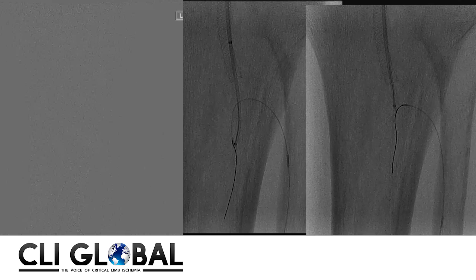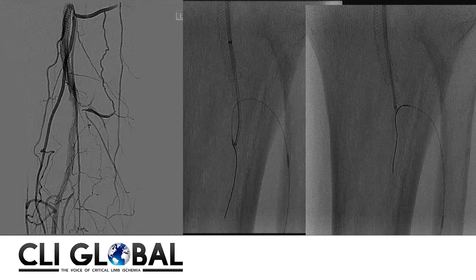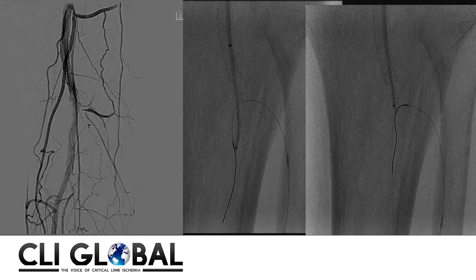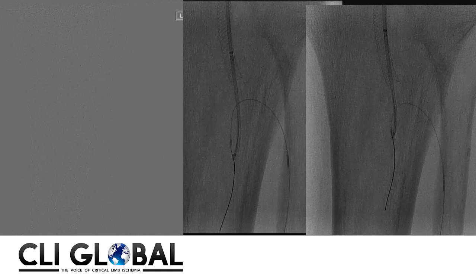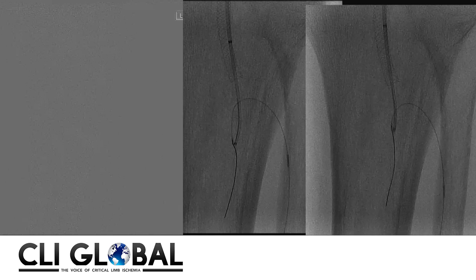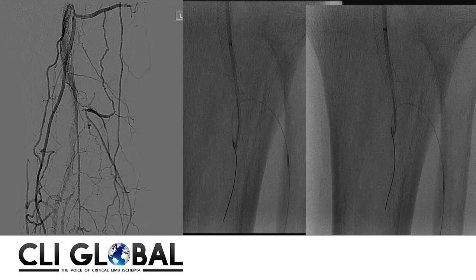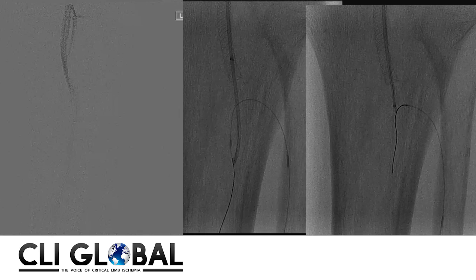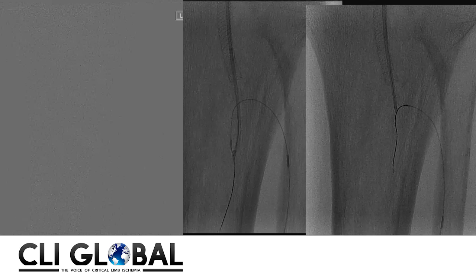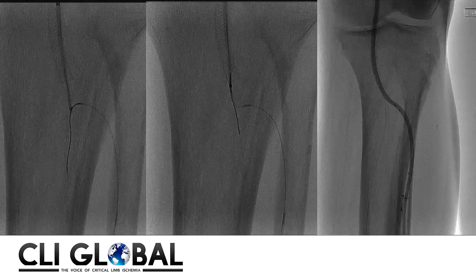We did not want to compromise the hard work achieved by re-establishing blood flow to the posterior tibial artery. In the middle panel, after crossing from the anterior tibial artery to the TPT and posterior tibial artery, we used a snare to capture the 014 wire — a Glide Advantage wire made by Terumo — and pulled it from the TPT trunk into the popliteal artery. This maneuver confirms crossing from the anterior tibial artery into the true lumen of the popliteal artery.